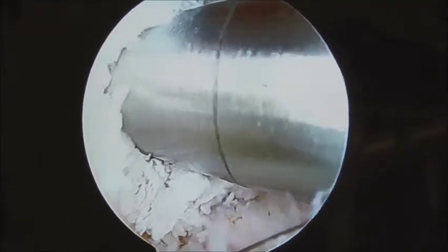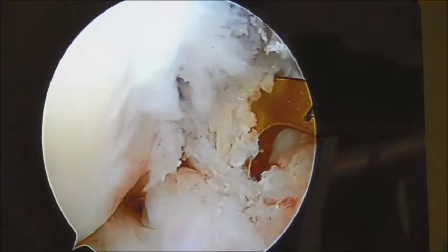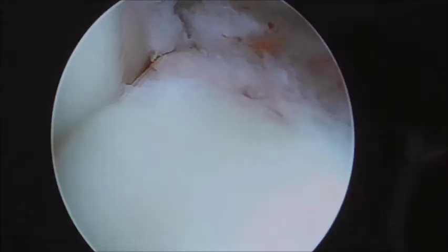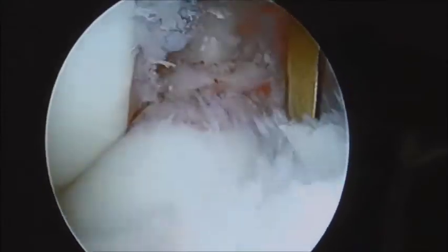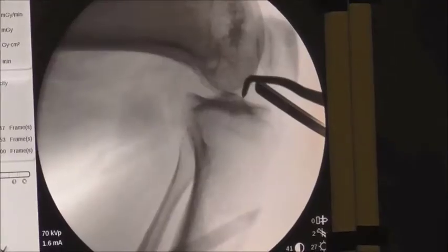Routine drilling and reaming of the femoral condyle is done for the loop endo button. Then for passing the tibial guide pin, the aiming device is put and a C-arm shot is taken. In this particular instance, it shows that it is too back. Again, adjustment of the aiming jig is made by considering anatomical landmarks like the anterior horn of the lateral meniscus, and it is positioned and a C-arm shot is taken.